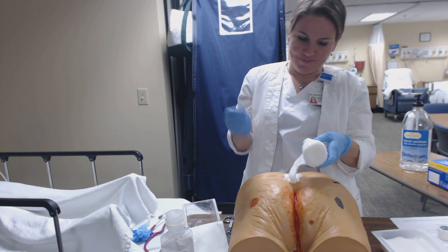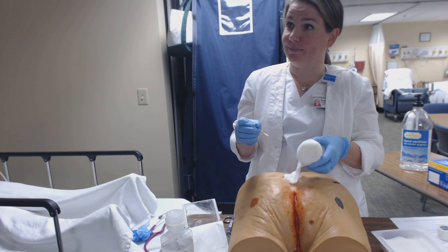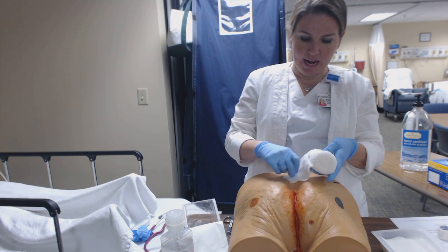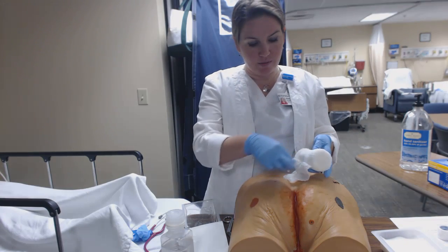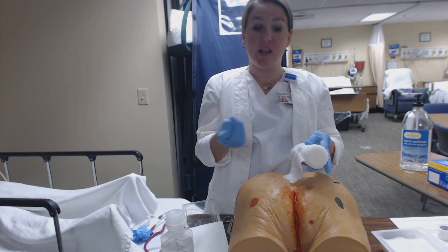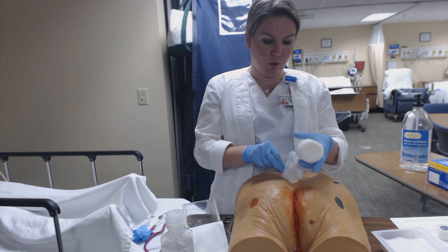What should you do, Miss Cammy, about the tunneling? So the tunneling you would pack as well. Oh, you have to go inside the tunnel? Yes. So this tunneling was not very deep, so I could kind of pack it in addition to doing this here. Sometimes you'll have significant tunneling where you may have to pack down in there quite a bit. But this is another reason it's important to have one complete piece so that you don't lose a piece of gauze in the wound bed anywhere.